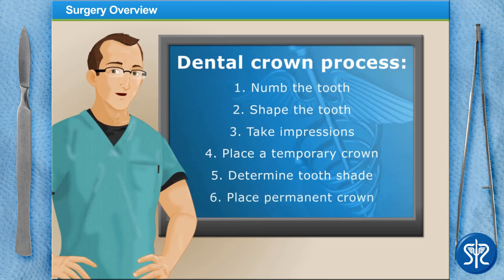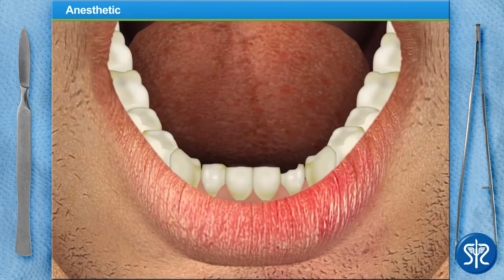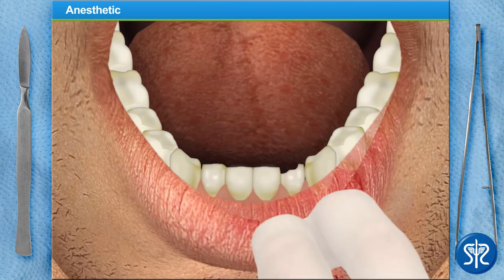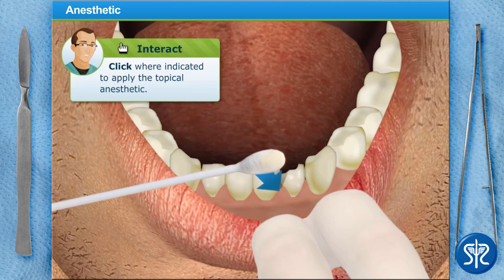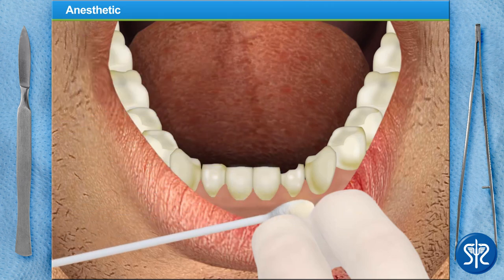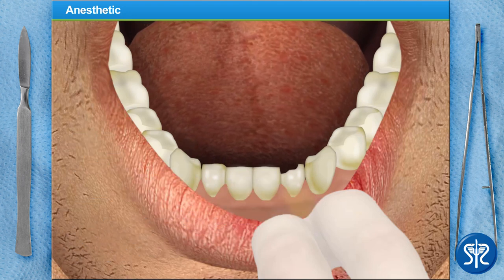Now let's put on our gloves and get down to business. First, place some topical numbing gel on the injection site — this will alleviate any pain or discomfort the needle may cause. Now we need to inject the local anesthetic.